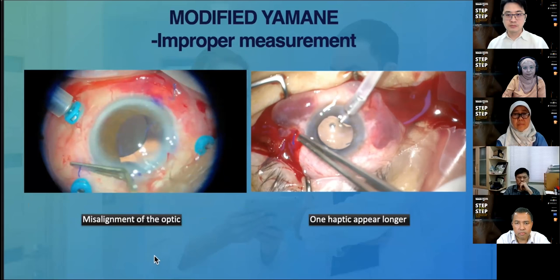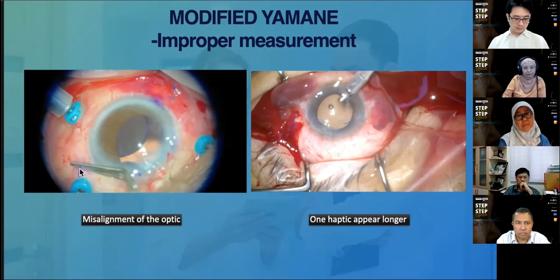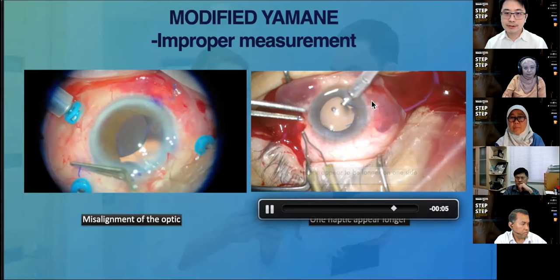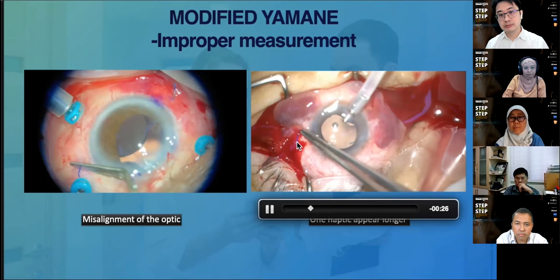Ideally, this one end should be here, the other end should probably be here. So this was a bit misaligned, so the optic appeared to be slightly off-centered. In another case, I think what happened is one haptic was probably measured at 2 millimeters, and the other haptic probably measured at 1.5 or 3. So that will also end up having an apparently longer haptic on one side.